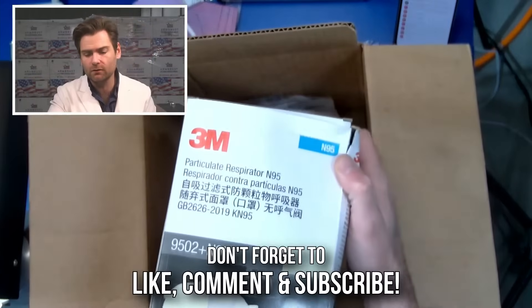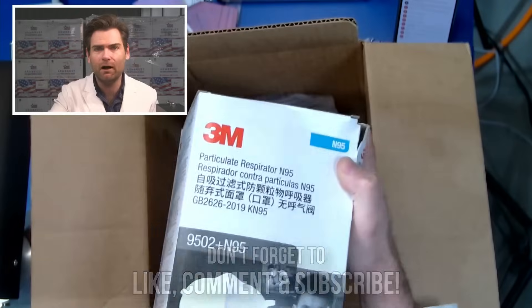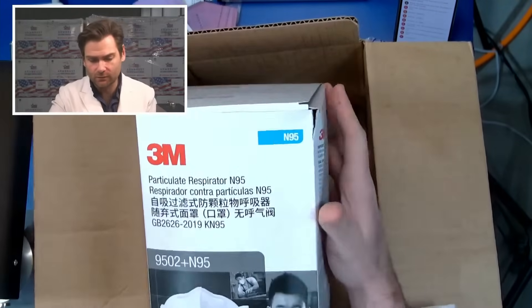Holy God. Why'd you send me so many, bro? I don't need this many. I just need the box and like three. I feel bad. This is awesome, though.